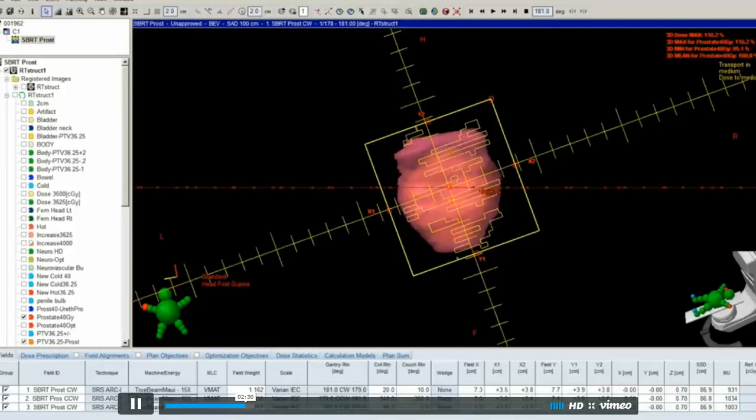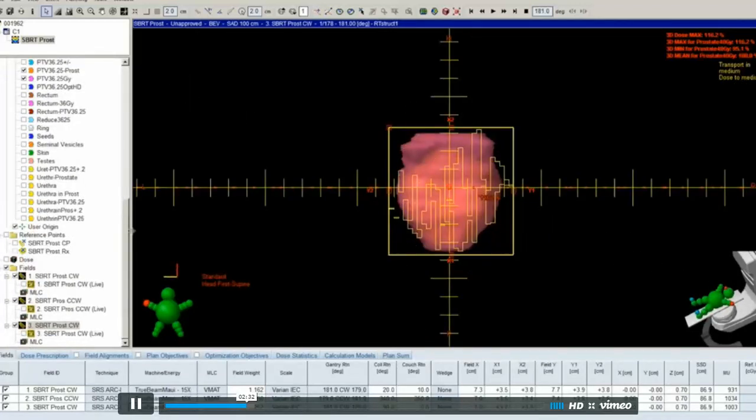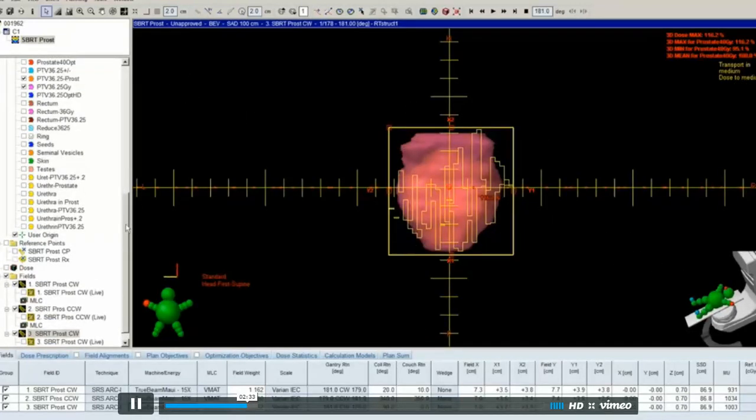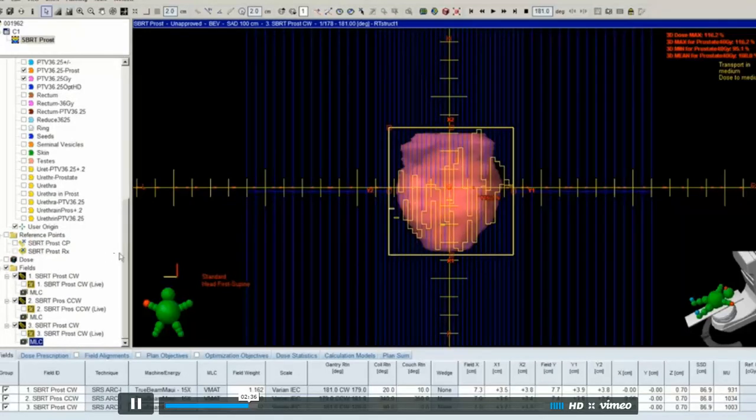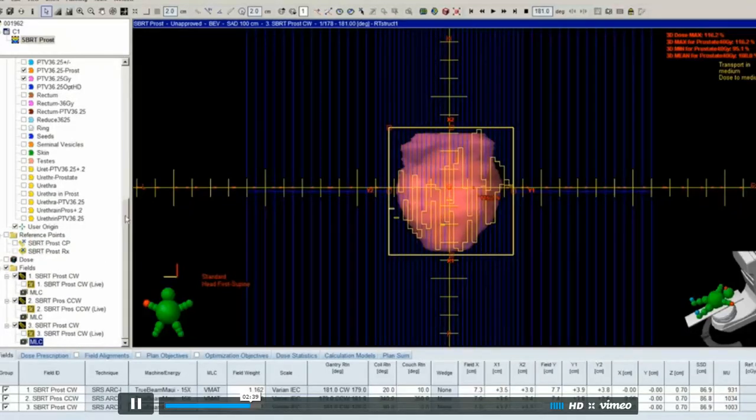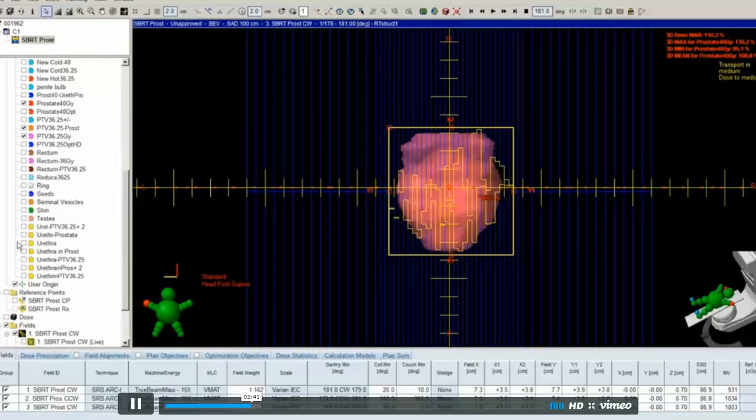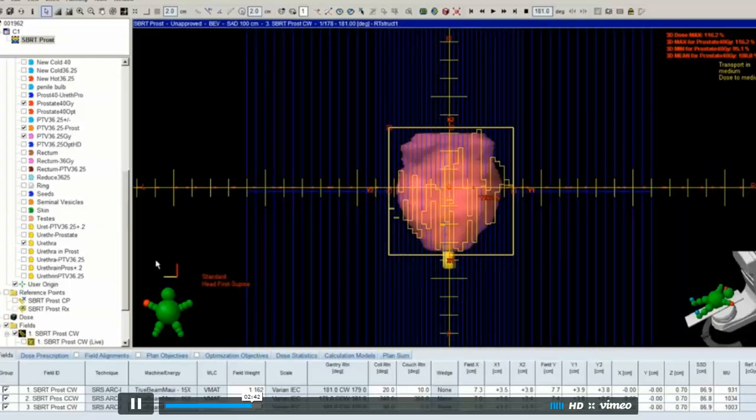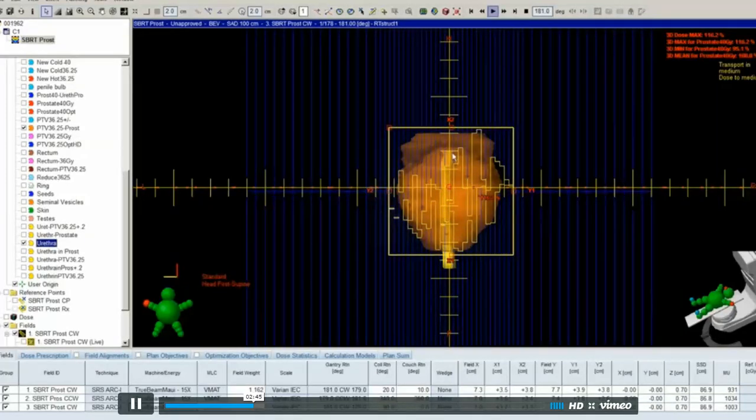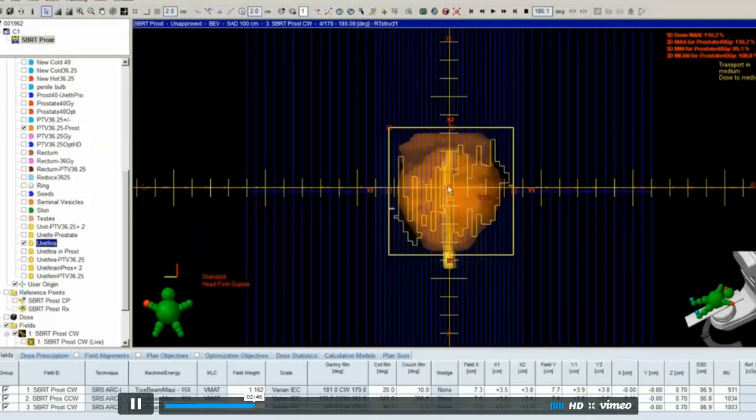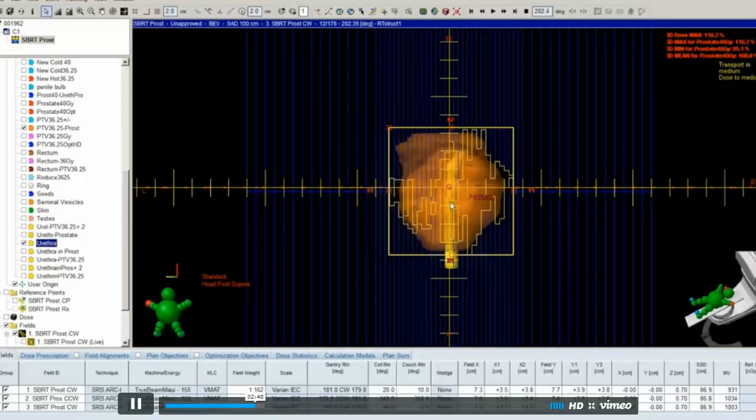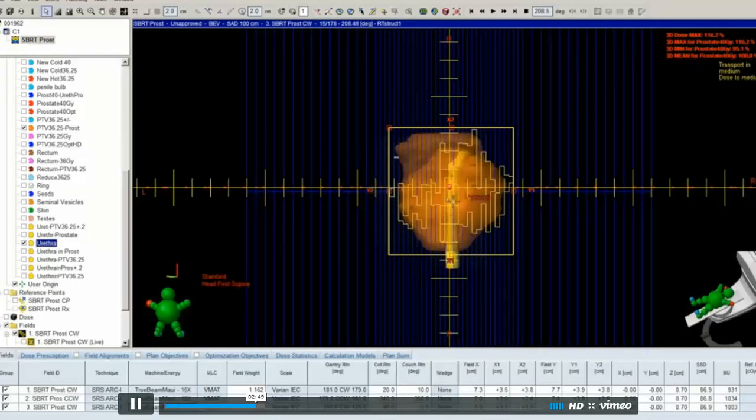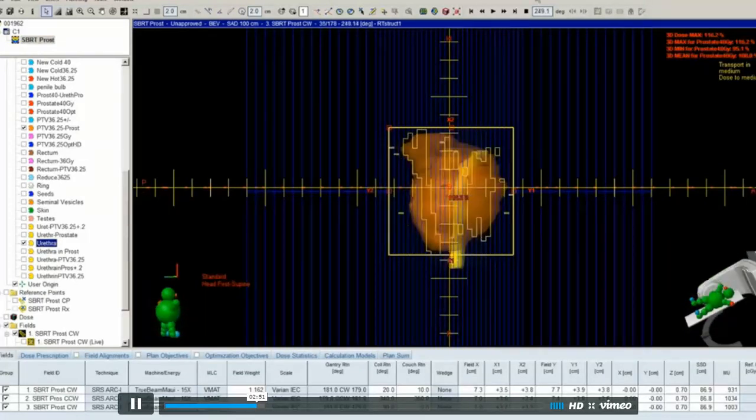One of my arcs, collimator angle of 90 degrees, what I was hoping to achieve with that is to have the leaves travel from superior to inferior, and in that way help spare the urethra. There it is, and if you kind of play it and watch it, it's kind of doing what I was hoping it would do. So that was my setup.